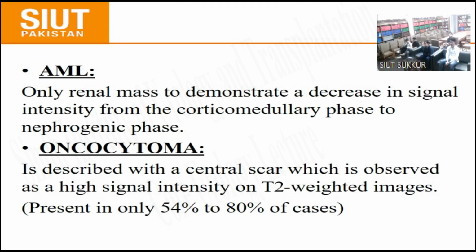Oncocytoma is described with a central scar, which is observed as a high signal intensity on T2 weighted images, present in 54 to 80% of cases.